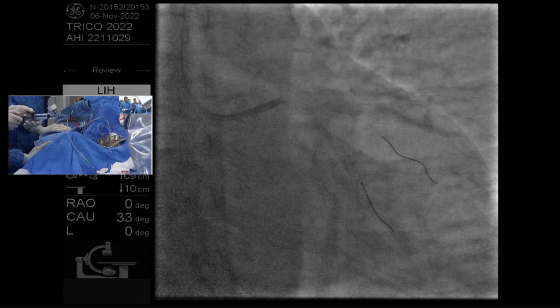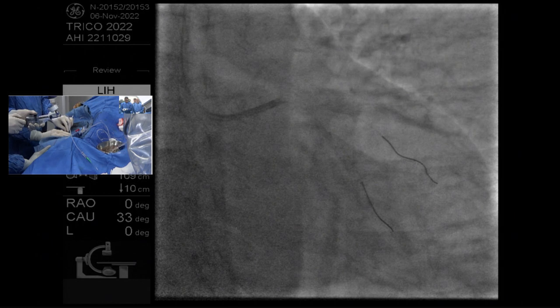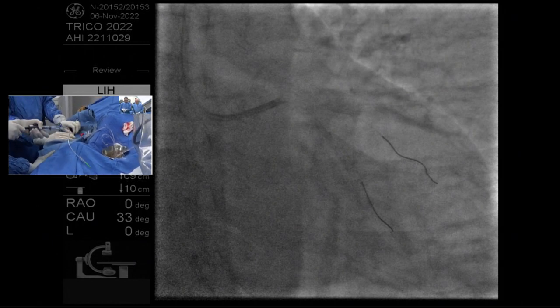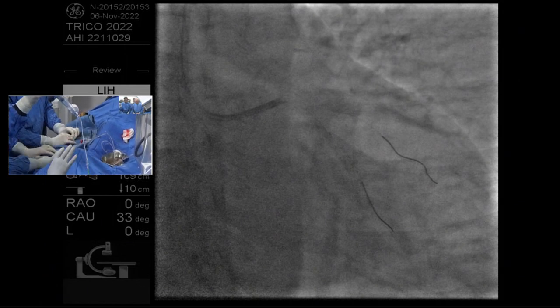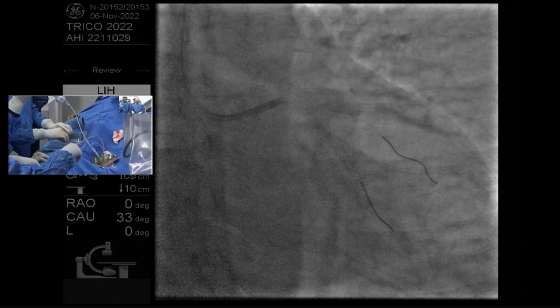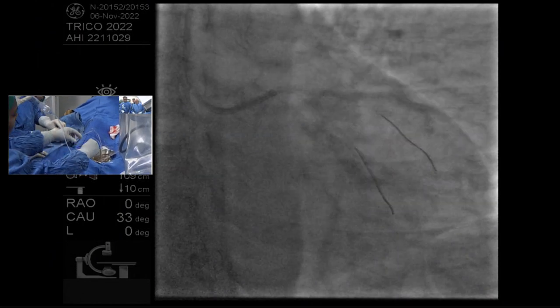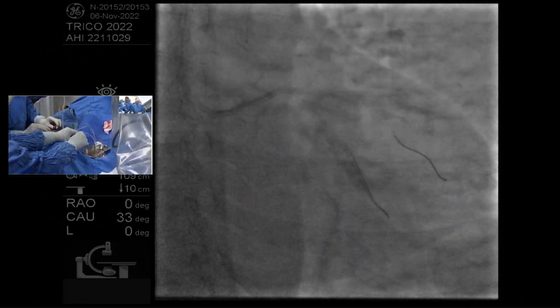Will give us some resistance. Exactly. And that is the most important bit, right? With zero contrast PCI, it's not that you're doing this blind. You're just learning to see differently. You're learning to see by how you feel. It's all about a blind man using a tactile feel. It's learning to see with the IVUS, all of these things. There is no magic here. This is a very straightforward procedure to do.